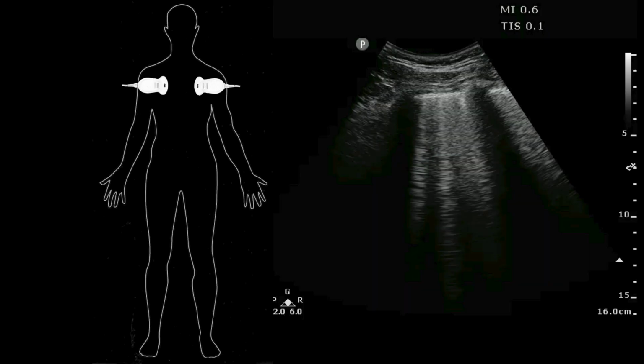But we're going to start in the anterior lung fields here and look at what we can find. So when you do this, you want to put your probe indicator cephalad, towards the head. You want to do the long axis of the body, the sagittal orientation, just to the side of the sternum. You're not going to see anything through the sternum, so put it in the parasternal space, long axis. I usually do it somewhere in the mid to upper chest. We're going to eventually move and look along the whole thing, but we want to just start in the mid to upper chest, right?